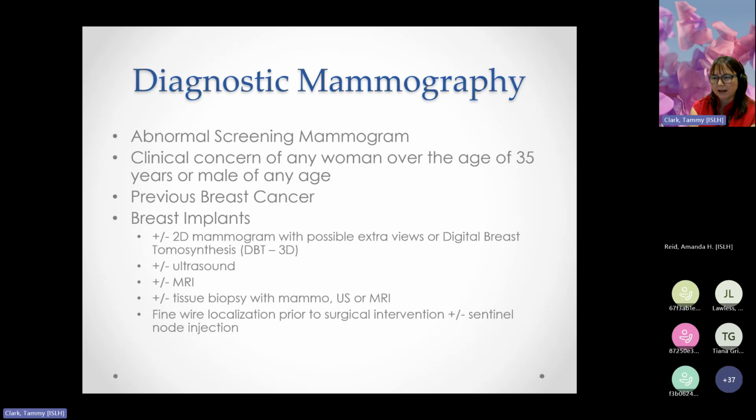Ultrasound is our most common adjunctive tool. So to me, mammography and ultrasound go hand in hand. So the more time as sonographers you can talk to your mammographer, ask them what they're seeing, talk to the radiologist before you do the ultrasound to correlate the mammogram, that's how you're going to have the most success with ultrasound. And the mammogram gives so many hints as a sonographer. So I'll kind of go into that as we move through the slides.